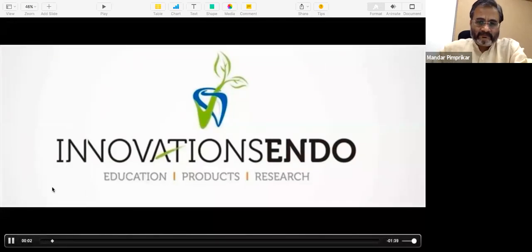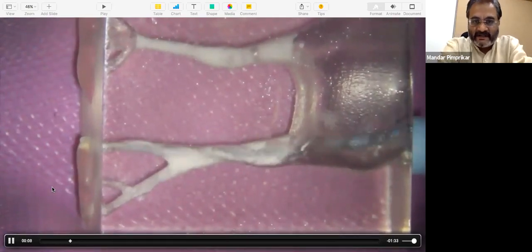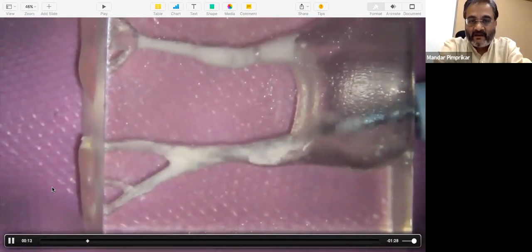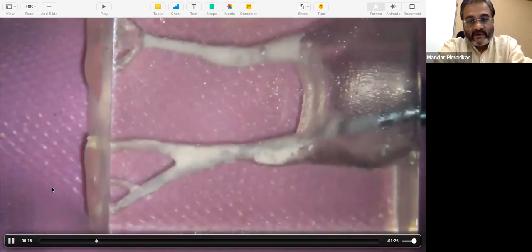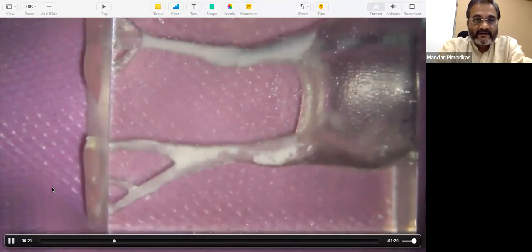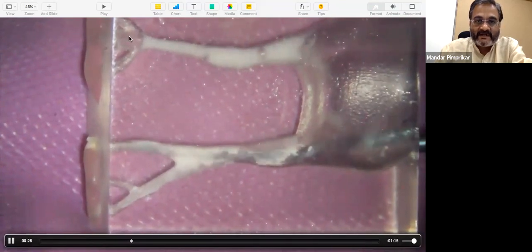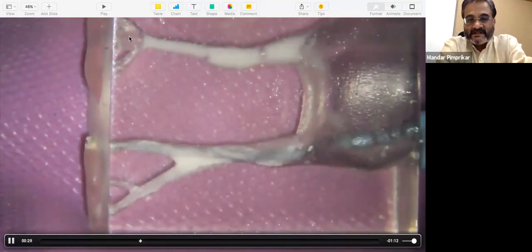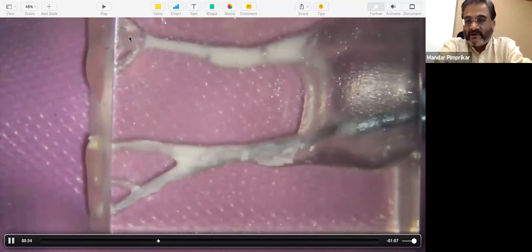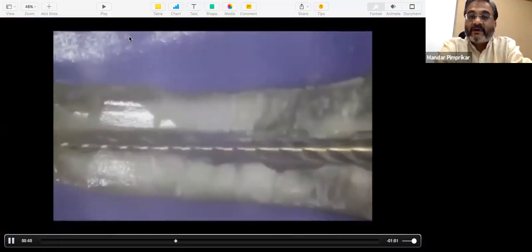Now, if you look at this complicated block, which I'm showing on the screen, the file starts to rotate in the root canal. If you notice, it is not contacting all the canal walls. Am I right? If you notice, it is generating a lot of tissue debris. Here you can see the apical vapor lock, where the solution is hardly present in the apical 1/3. So what we need to understand is an endodontic file will only contact only 30 to 35% of the root canal walls. The rest all has to be done by your irrigants.